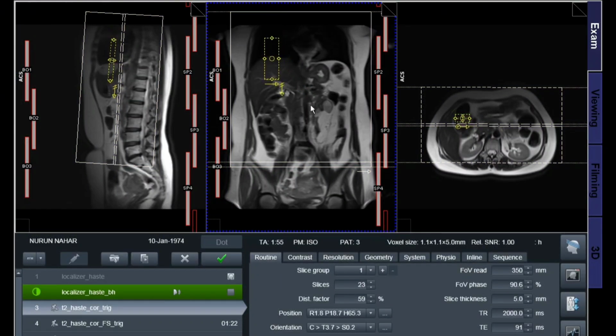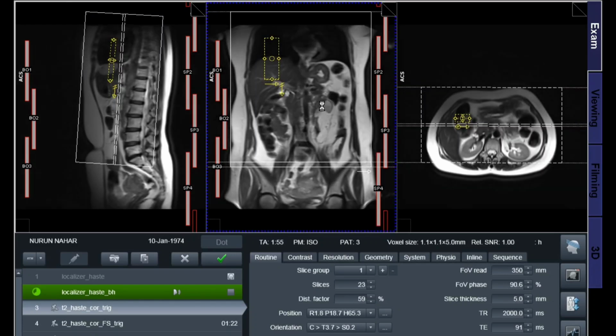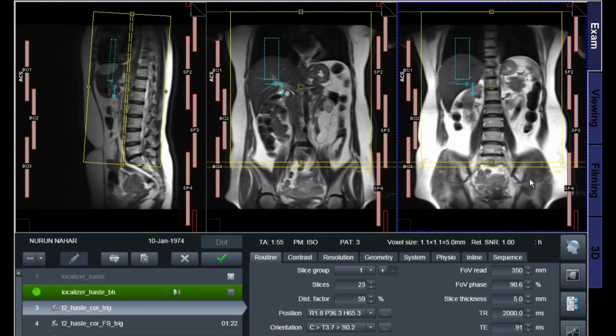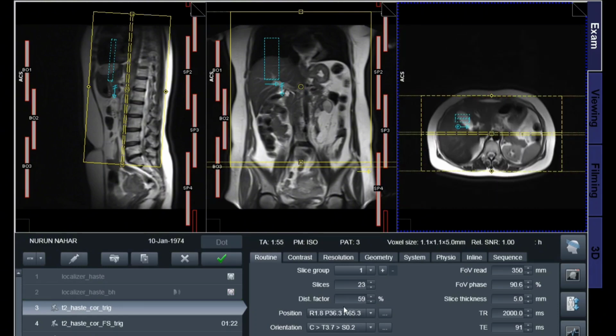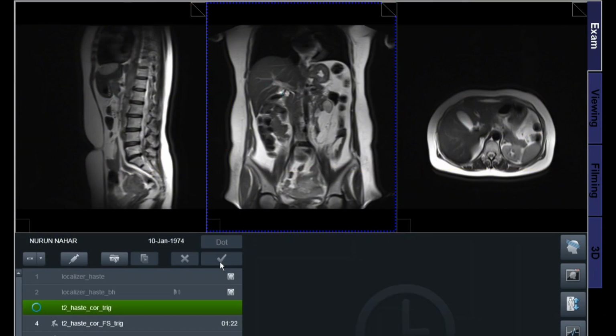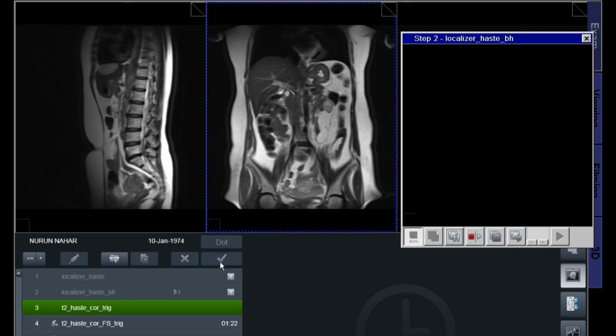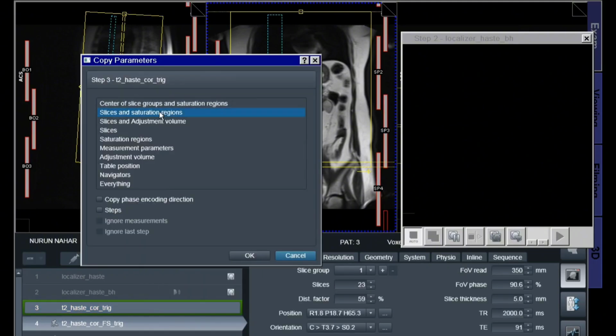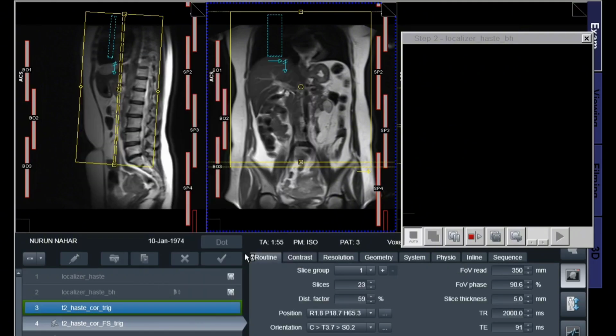Today we will discuss MRI HBS, which stands for Magnetic Resonance Imaging of the Hepatobiliary System. In this video, we will cover what is MRI HBS, anatomy of hepatobiliary system, indications, MRI technique, sequences used, contrast MRI HBS, common MRI findings, clinical importance. This video is useful for medical students, doctors, radiology technologists, and general viewers.